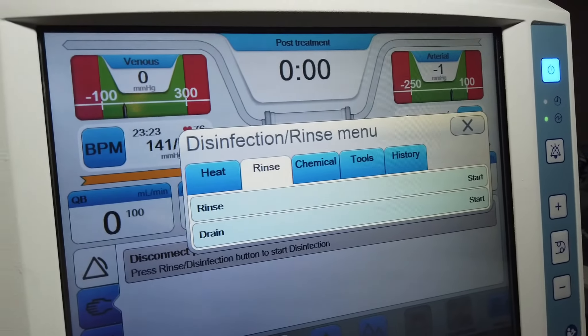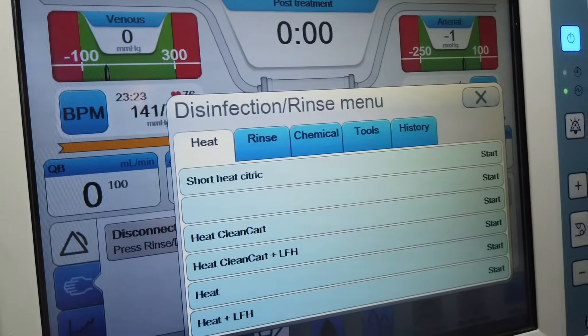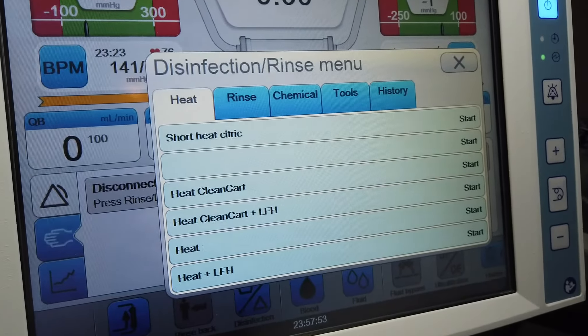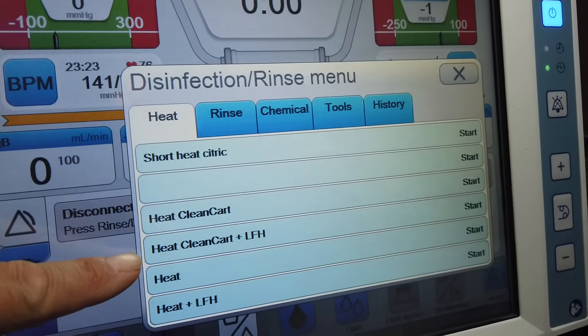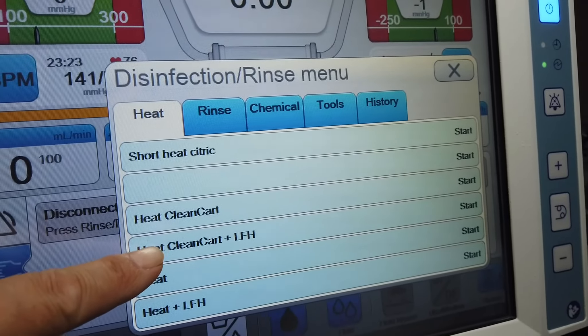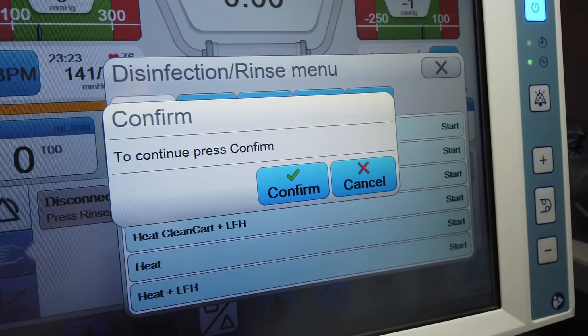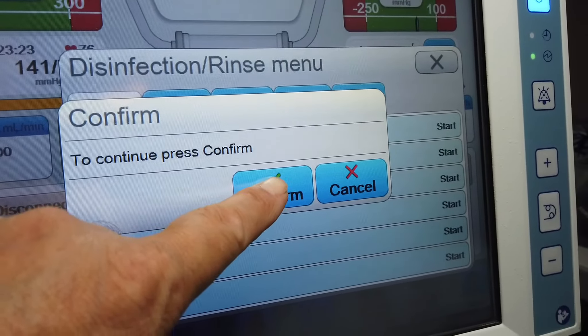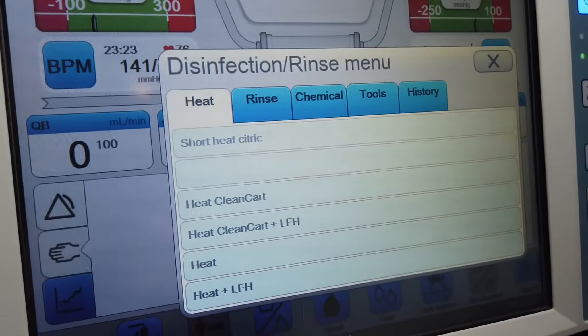We have the menu that gives you the option of rinse, heat, and so forth. We're going to push the heat button. The choices are: heat clean cart, heat clean cart plus LFH, and heat. For the A machine, we use heat clean cart plus LFH, and then we press confirm.